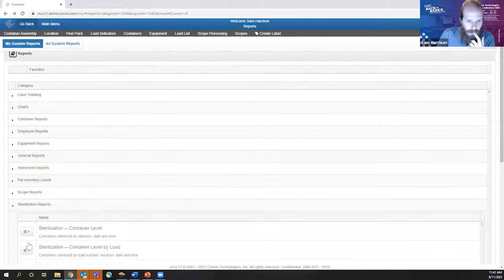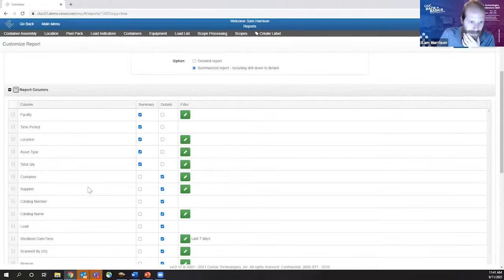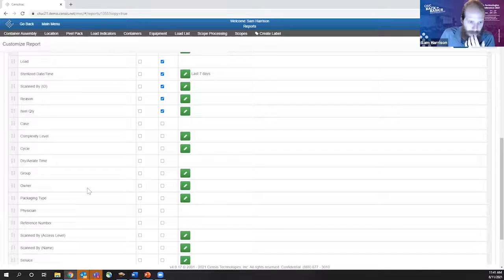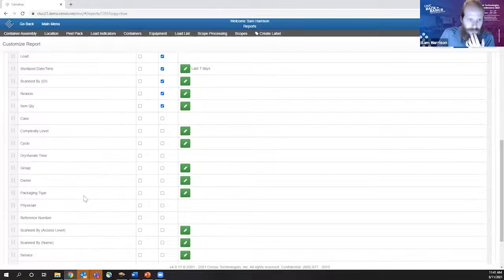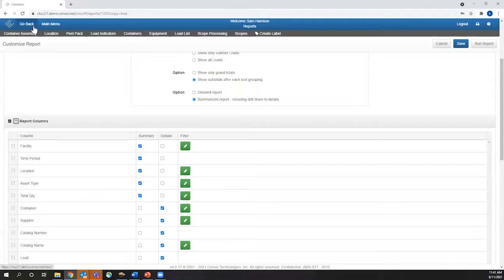Maybe it's, no, it's not that. Maybe it's this one. Yeah, I don't know that leak test comments. I don't recall ever seeing that. I don't know if Kelly or anybody else is aware of that. It's in there, but I would need a few minutes to pull up the reports and find the exact one.